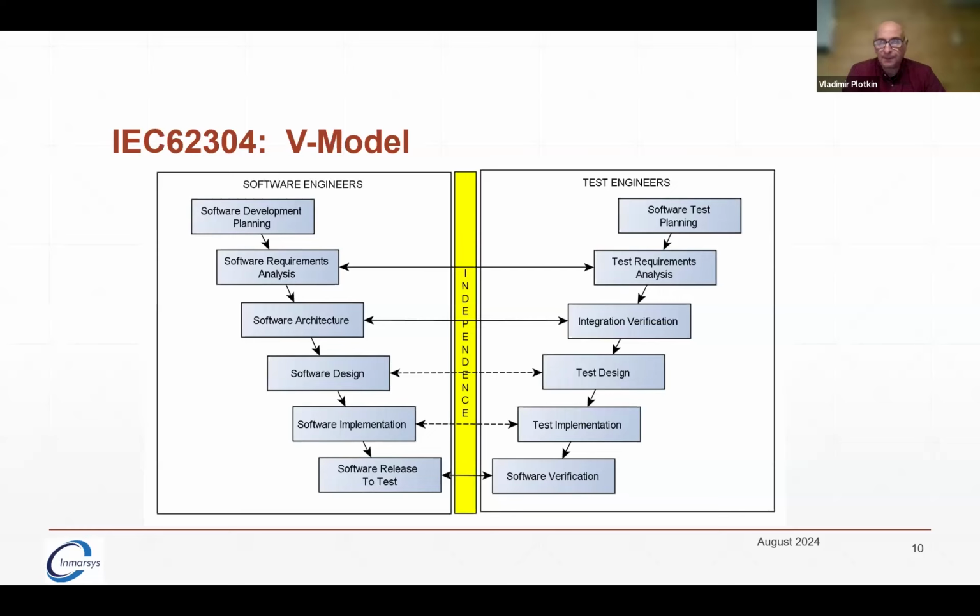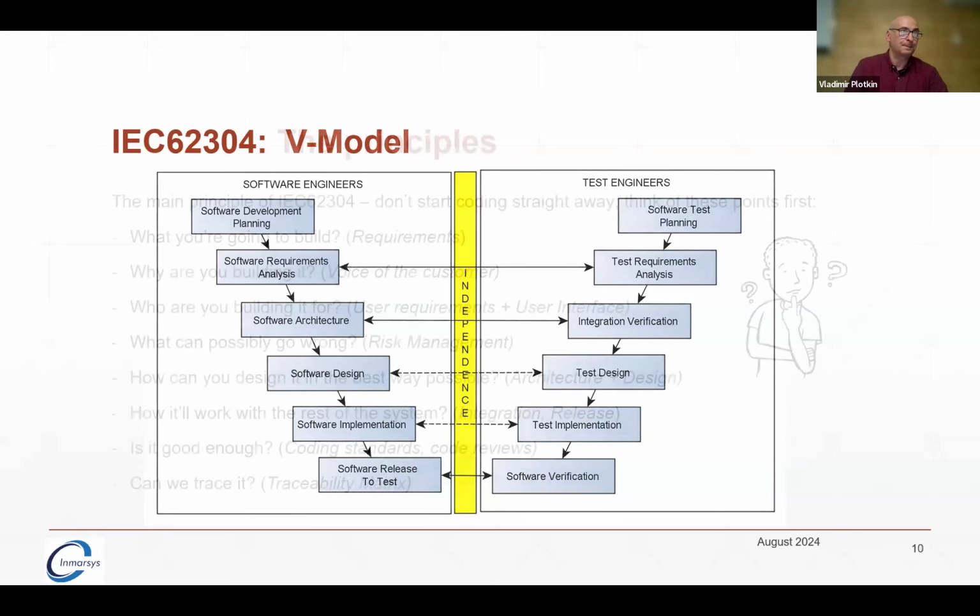It's an issue. So the important bit is to have your software test team basically allowed to do their job, not to apply pressure onto them. That's a very important bit to remember.